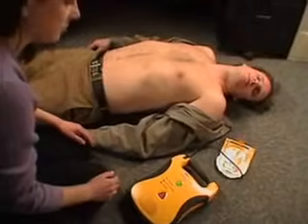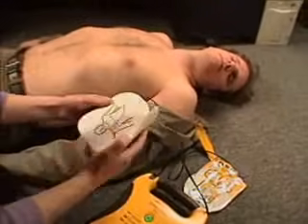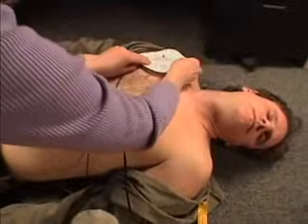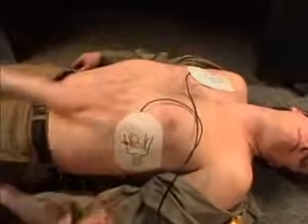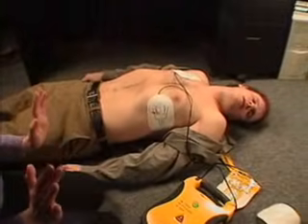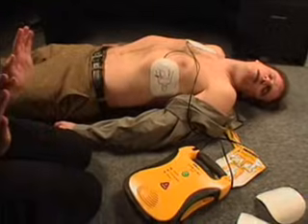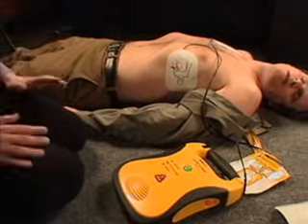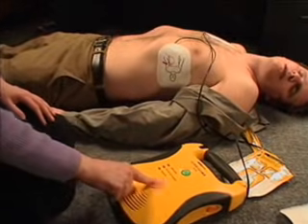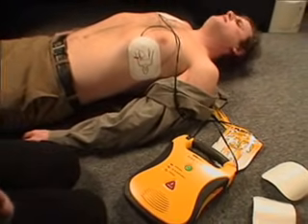The Lifeline AED is designed to be so simple to use that virtually anyone can save a life. The device guides you through each step with voice prompts: Call for help. Apply pads to patient's bare chest as shown. Analyzing heart rhythm — do not touch the patient. Shock advised. Charging. Stand clear. Press flashing shock button. Shock one delivered. It is safe to touch the patient. Begin CPR now.